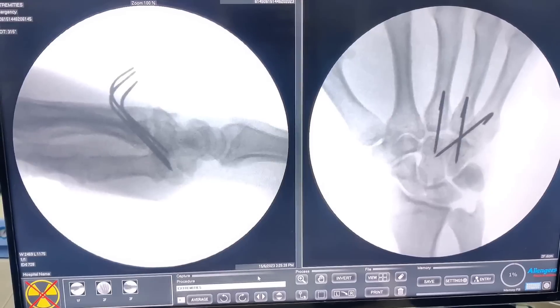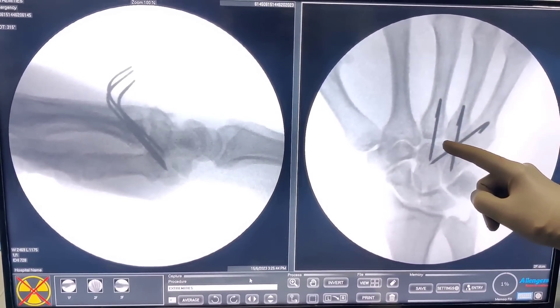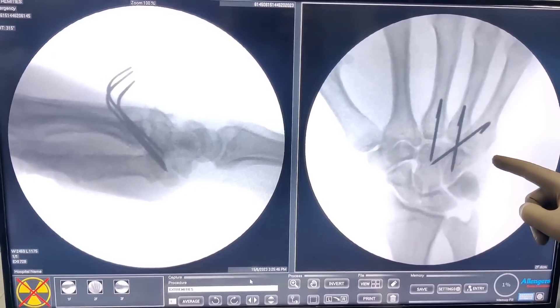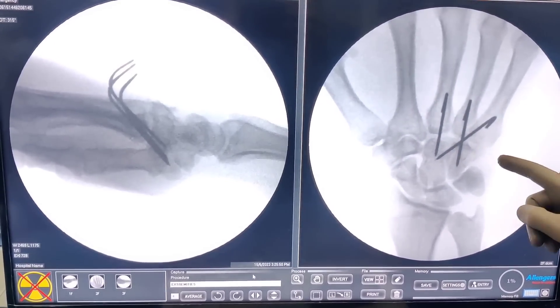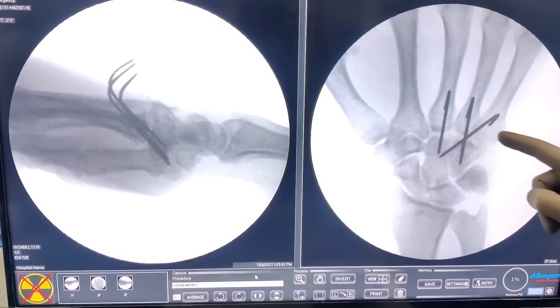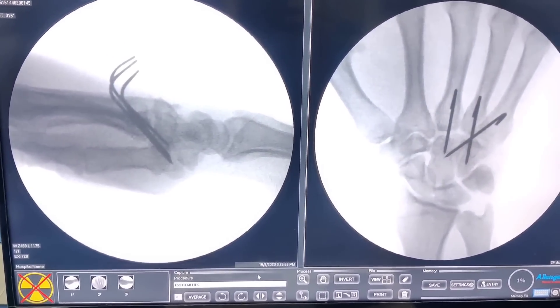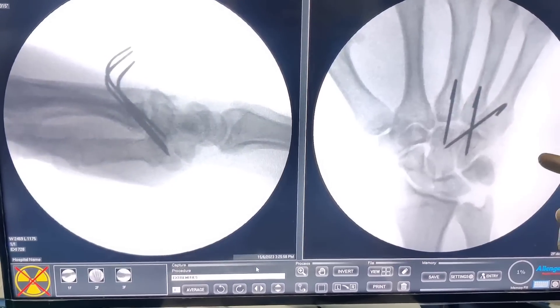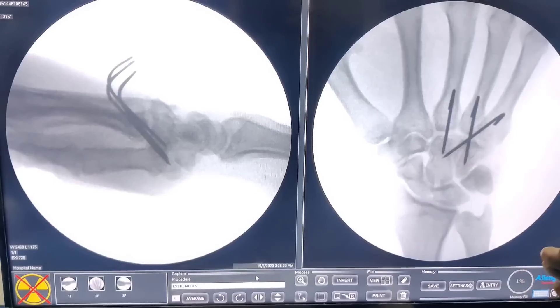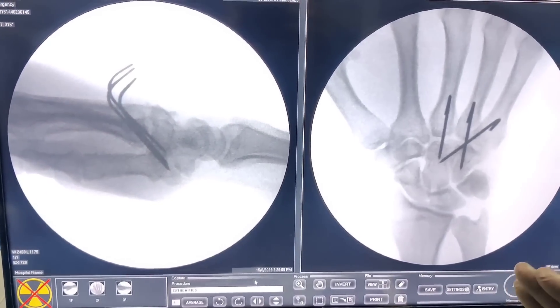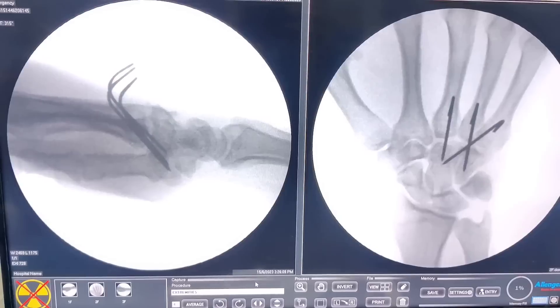This is our final image and it looks beautiful. You can see small joint spaces here, here, and here — this means the joint is anatomically reduced. On an AP view, if you do not see these spaces an experienced clinician can make a diagnosis of carpometacarpal dislocation. However, if you have any doubt or if you are at the beginning of your career, do not forget to take the true lateral view. This gentleman will go in a back-slab for roughly 2 weeks and then we will put him in a cast for a further 4 weeks.